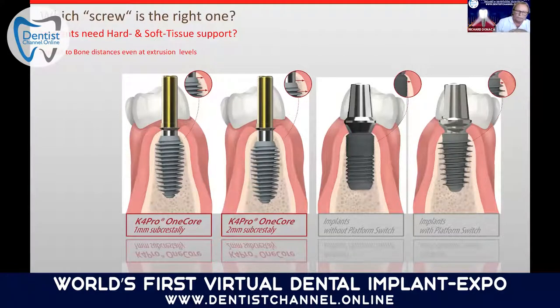So as you can see here, we place the implants subcrestally. The ideal implant placement is a subcrestal implant. You can place the implant 1 millimeter, 2 millimeters, and the deeper you can set the implant, the more, of course, bone retention and the more seal you will have around the bone and the soft tissue area. Whereas many implants that are set at the crestal level of the bone have a very short distance from the implant to the outer bone of the cortical plate, as well as some other implants also.